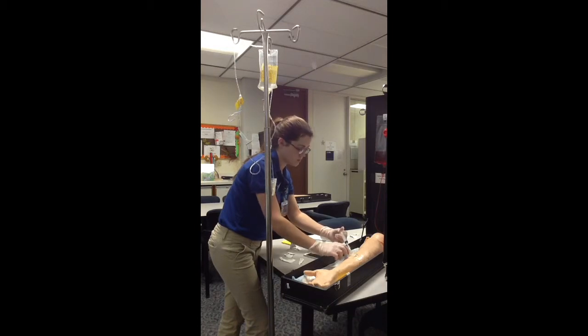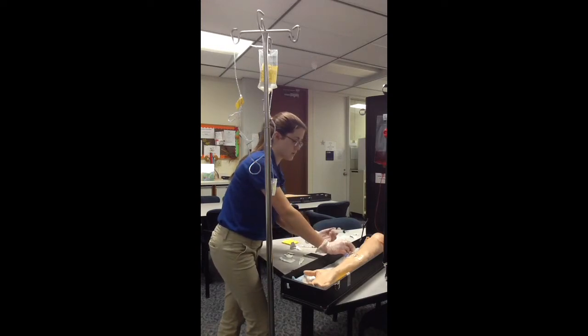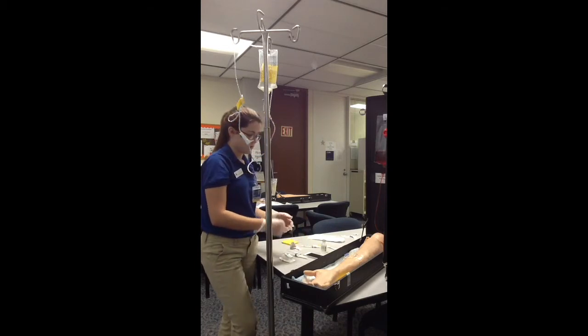Okay, and I am clamping as I am removing the needleless device to establish positive pressure. Okay, and now I'm done.